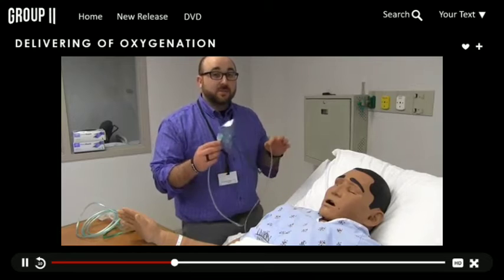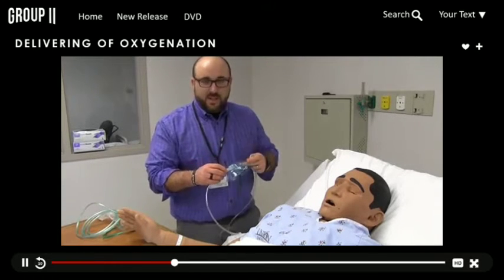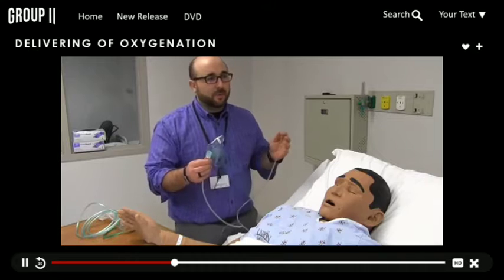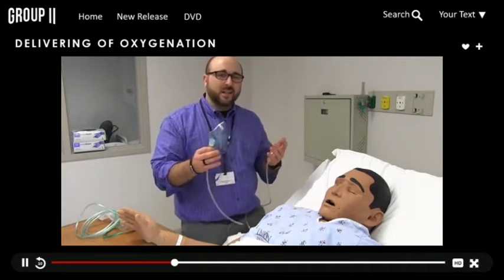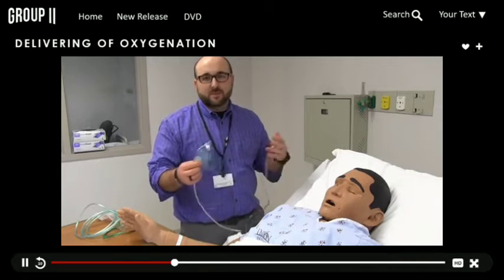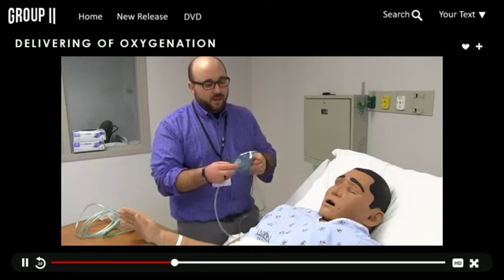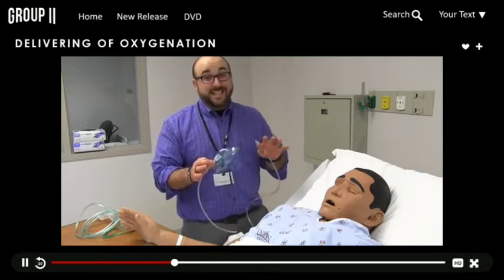Alright, so I'm going to talk about the simple masks now. A simple mask is a device we see a lot in our post-surgery area. It's a nice way to deliver some oxygen. Also, I've seen it in labor rooms. They give it to a laboring mother if she needs some oxygen and doesn't like a nasal cannula. It's a nice way to deliver oxygen, but it's a very poor way to give an exact amount of oxygen.